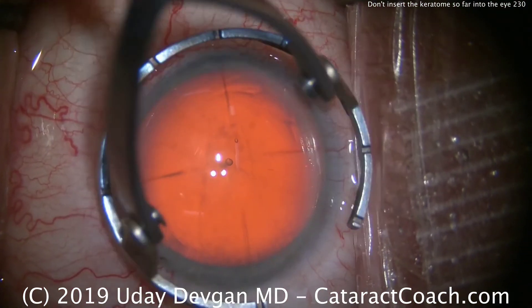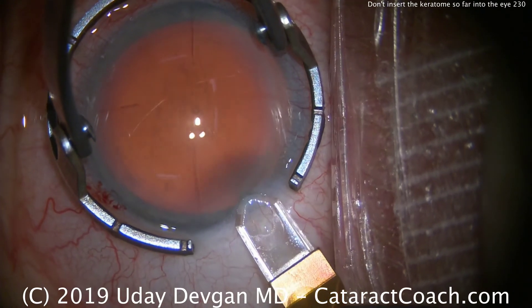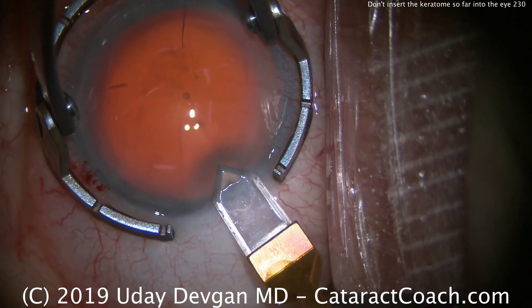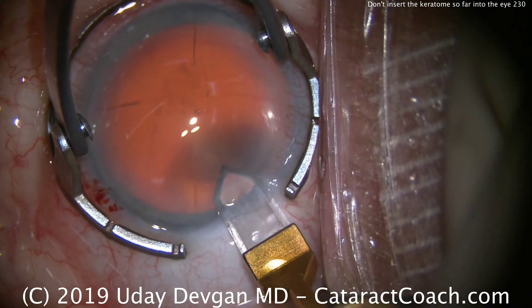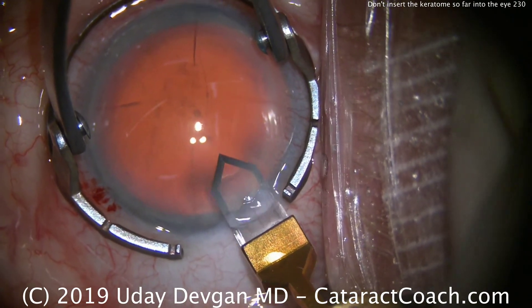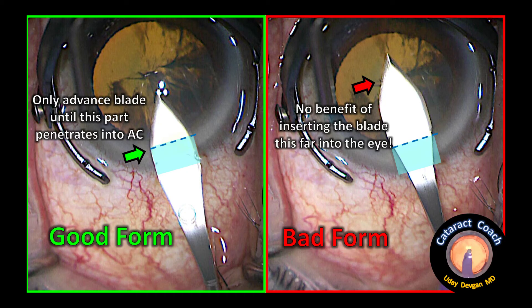Let's show you one more time with the diamond keratome — same concept. Nice and slow. Start your incision, advance it. As soon as the tip pierces Descemet's, go till the widest part of the blade, and then come out. The danger of going so far in the eye is also that when you come out, you'll enlarge the incision too much, causing leakage and unstable fluidics.